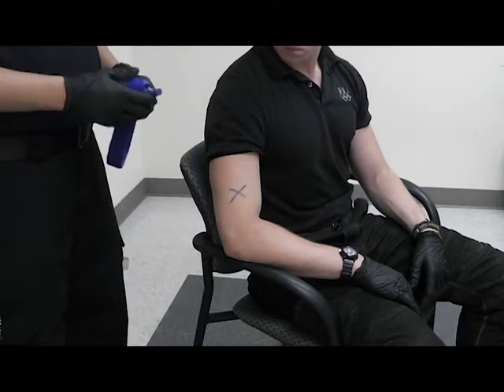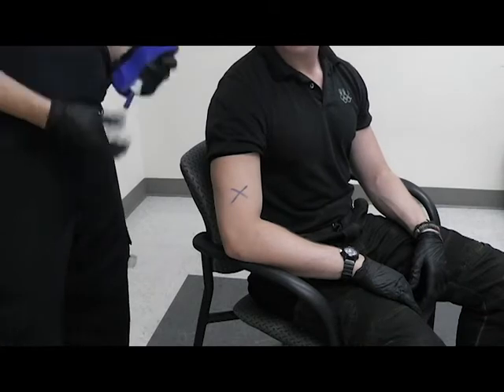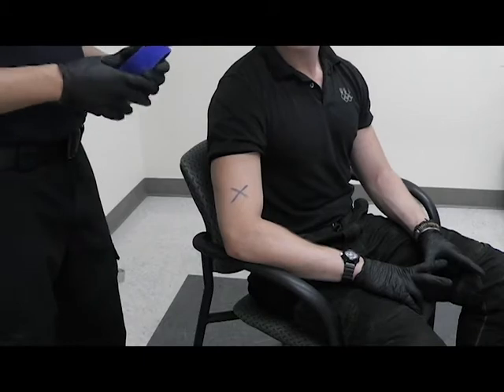This is a demonstration of bleeding control, shock management, and tourniquet application. First of all, I'm going to start with my scene safety VSI, so I have my gloves and my scene is safe.